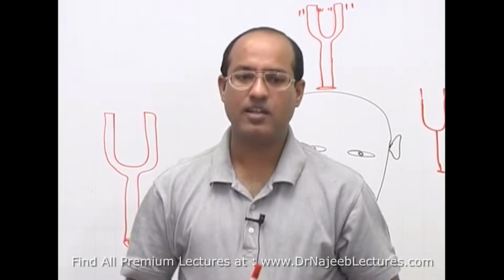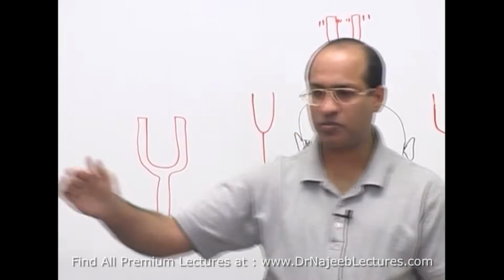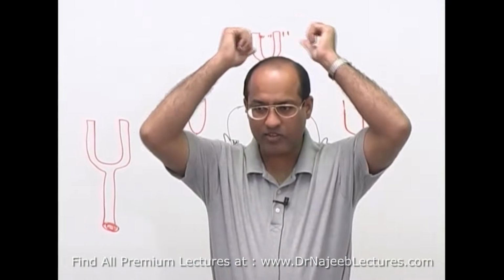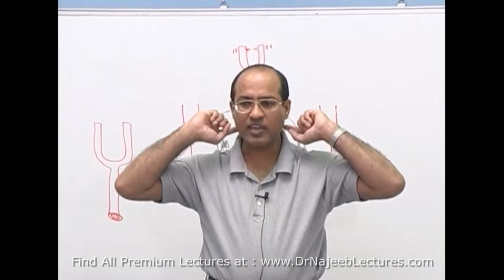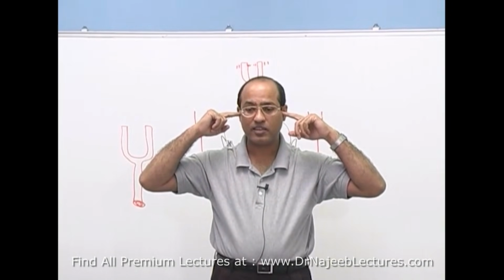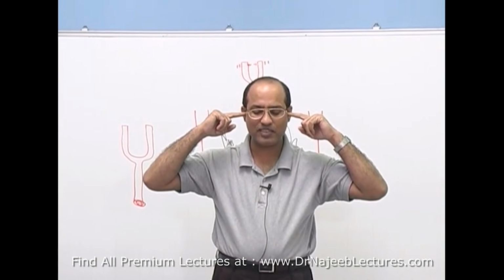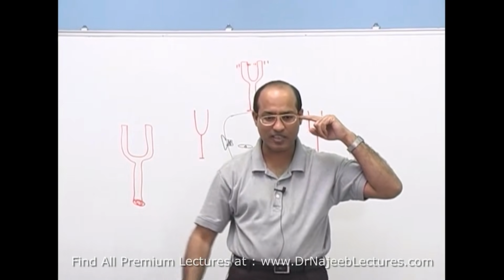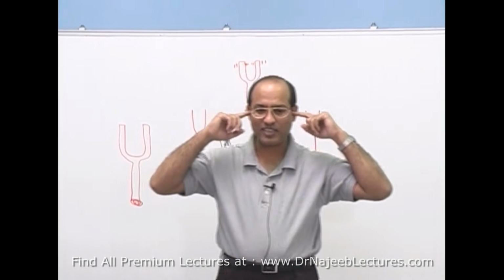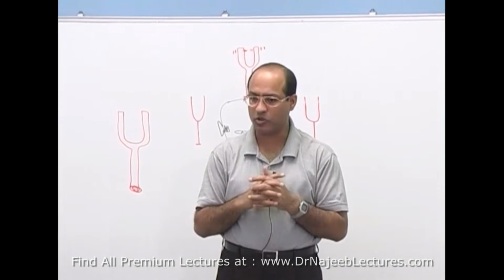Is that right? Now let's sum it up. Number one, the first person comes, you do the Weber, it does not lateralize. You do the Rinne's on both sides, and air conduction is longer than bone conduction. What are the conclusions? A normal person, normal ears. Maybe he has a gunshot injury here, right? Normal ear, okay. Is that clear? Number one: no conductive deafness, no sensory neural deafness.